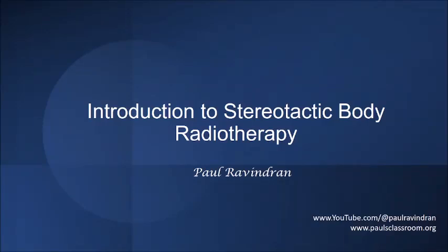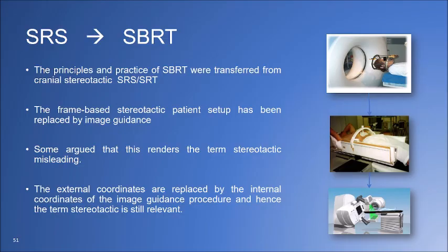This is a very short introductory lecture on stereotactic body radiotherapy. The principles and practice of SBRT were actually transferred from SRS or SRT that we were doing for cranial. When we wanted to go for extracranial, the entire principles were transferred to that.